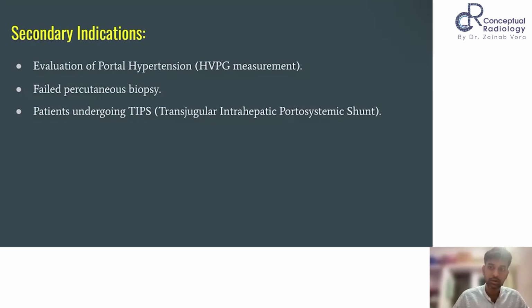It contains a lot of blood-filled cysts within. It's a benign lesion. However, it has a risk of increased intraparenchymal hemorrhage when we do a percutaneous biopsy. Although in most cases it is diagnosed on imaging, in doubtful cases we need to do a biopsy, and TJLB is preferred compared to percutaneous biopsy in those cases.